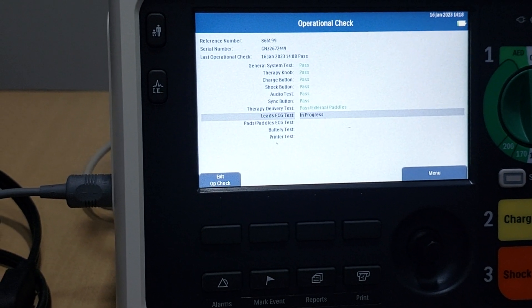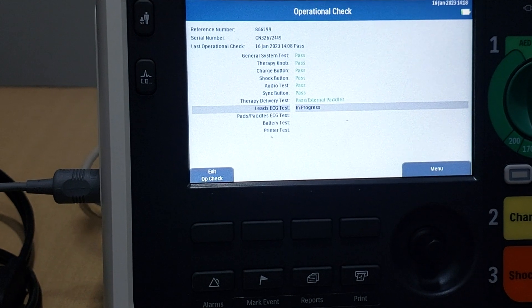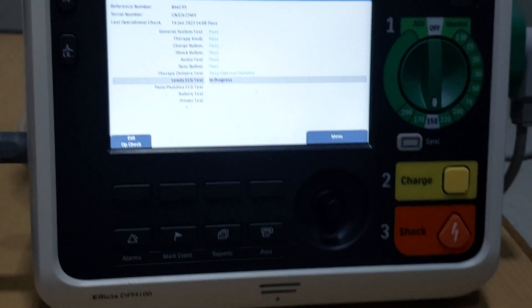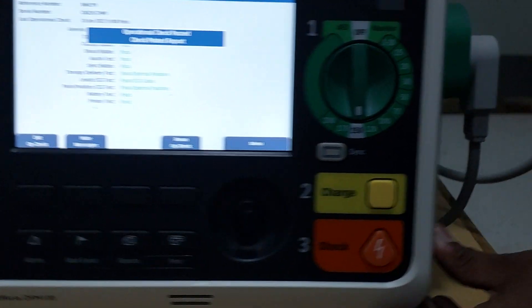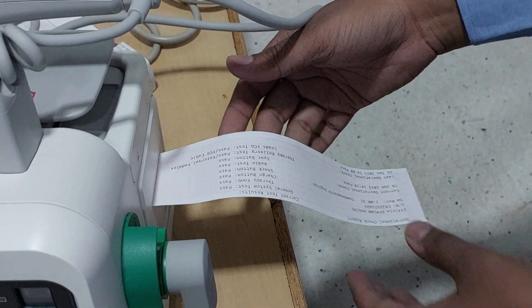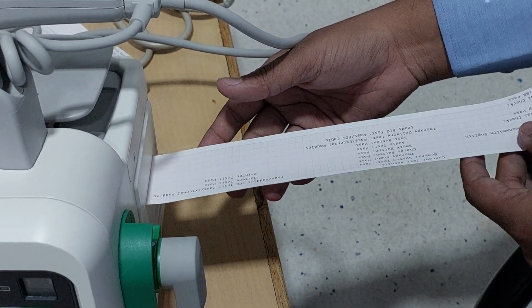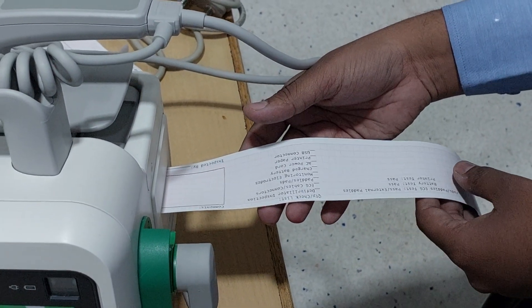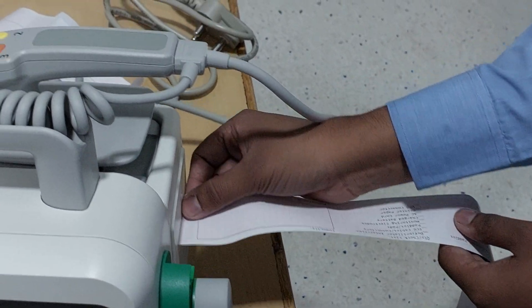Now the lead ECG test is under process. Every early morning you have to follow this entire process. After completion, the machine will give you a printout. In the printout everything will be mentioned properly, including machine serial number, model, type of test, battery test, printer test, ECG results, and everything. If there is any fault inside the machine, it will also be noted on the printout.